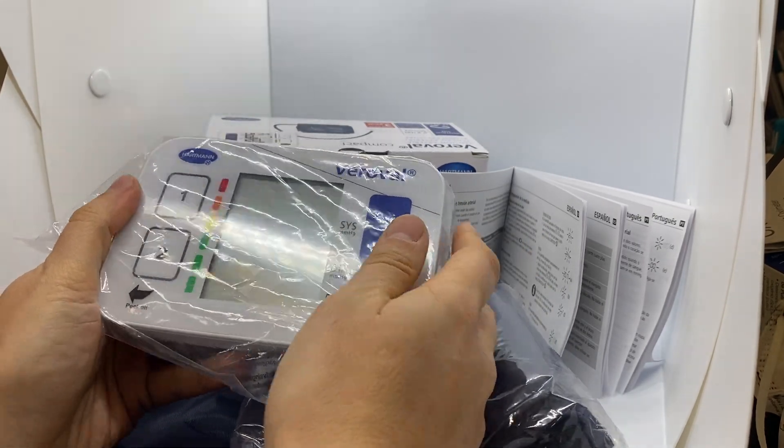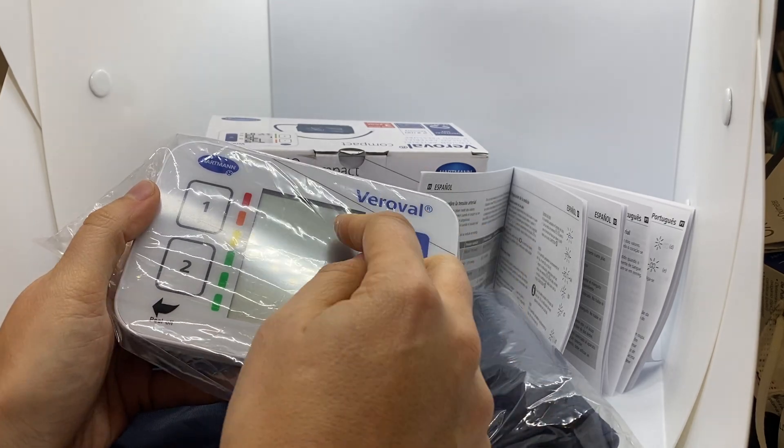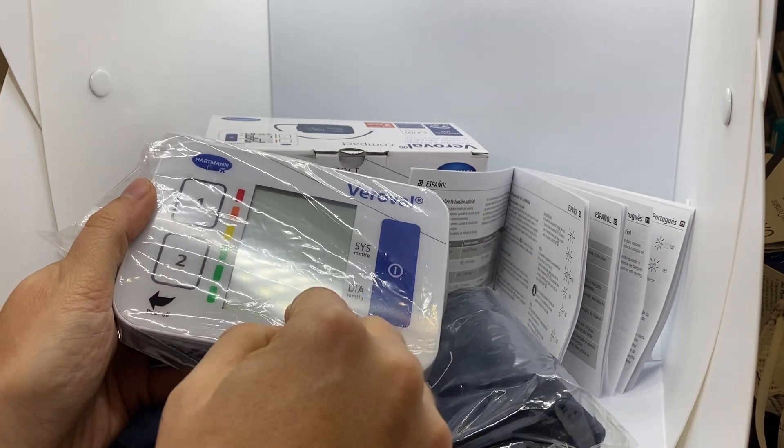and it will give you the measurement — the arterial pressure, systolic and diastolic, and your pulse.